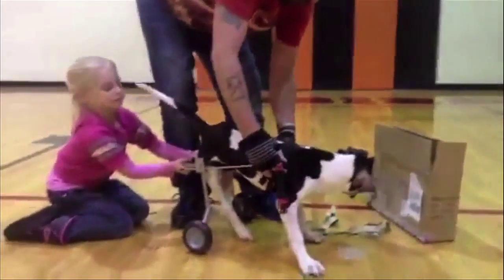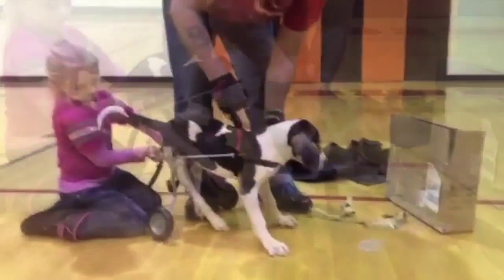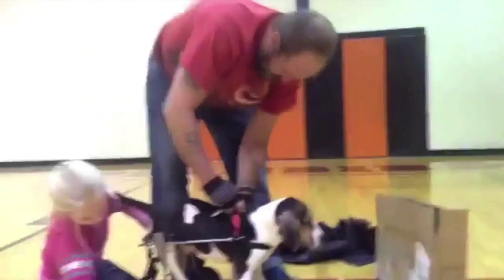The chair just goes around them like that. It's got a strap. Legs have to go through the chest section, and then it straps around his back.